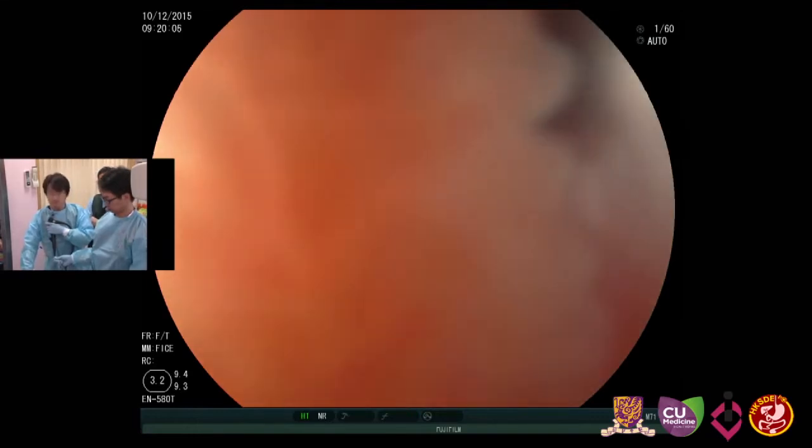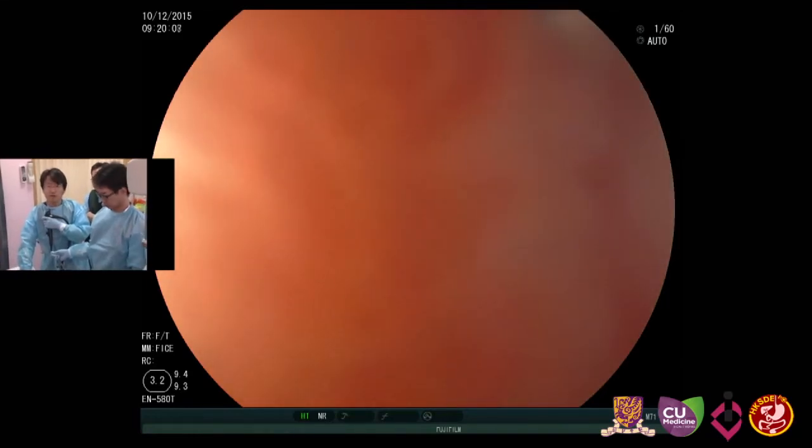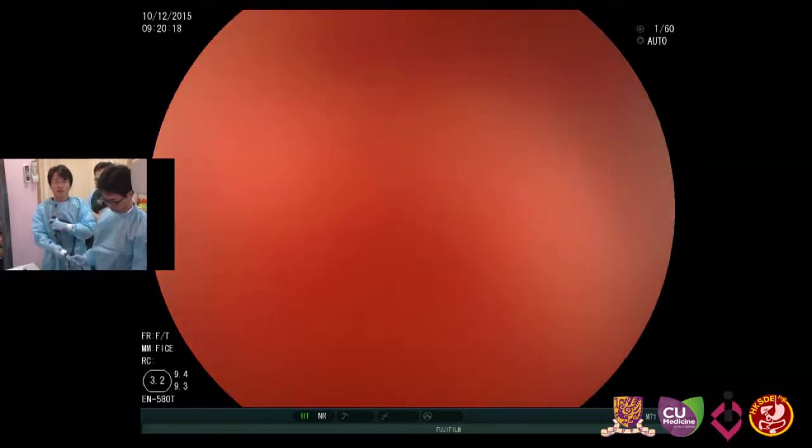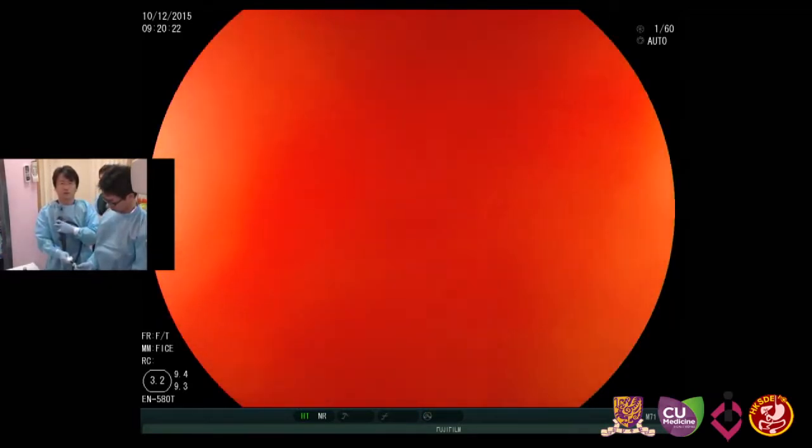Advance the endoscope and inflate the endoscope balloon and deflate the overtube balloon and insert the overtube along the endoscope. Now, is it true that in post-op anatomy, sometimes you like to not hold the scope completely straight? Because sometimes you make the angle more sharp if you're holding the scope.